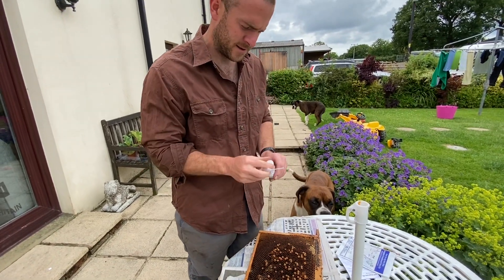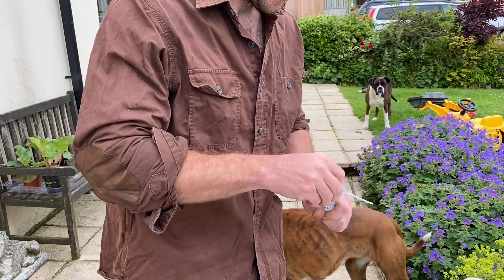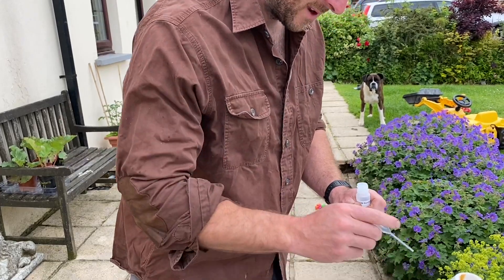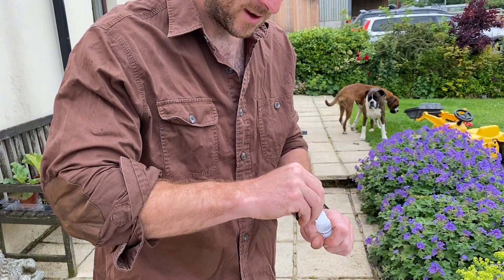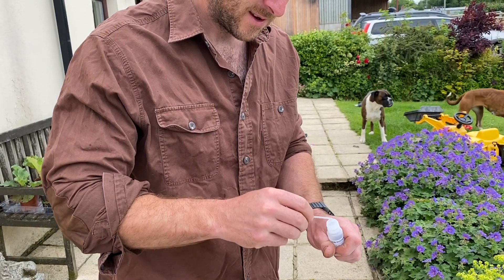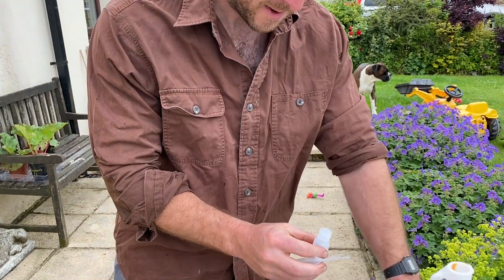Now with that bit of larva in there, you're going to shake it for 20 seconds. Then we're going to take the pipette and take a bit of that solution — you squeeze the pipette in, which creates a vacuum, and it sucks that solution back up.